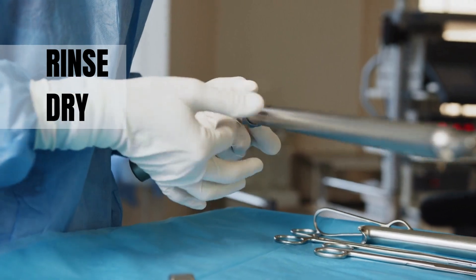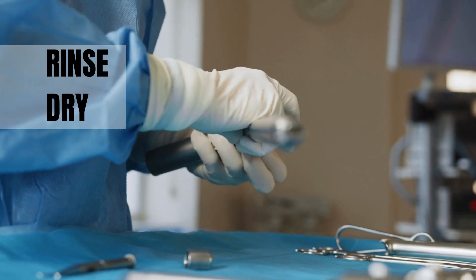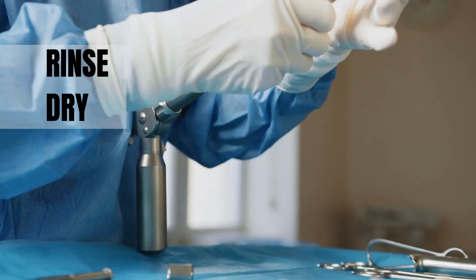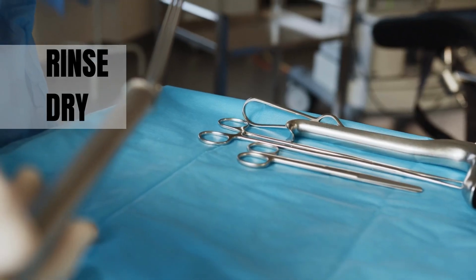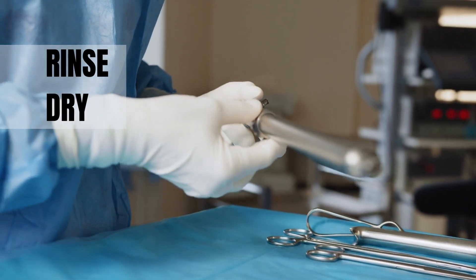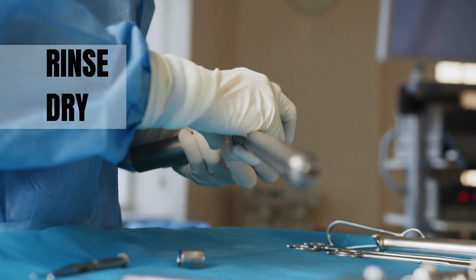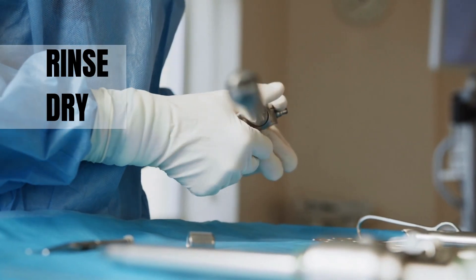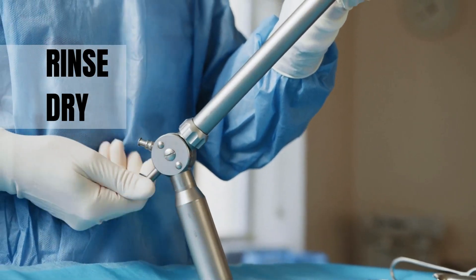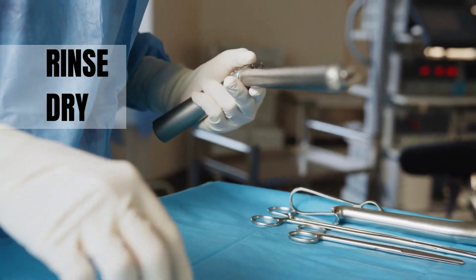Once complete rinsing is done, all instruments must be dried thoroughly. It is advisable to dry them with the help of an air dryer, but if that is not possible, you can wipe them dry with a cloth and place them in open air for some time for complete drying. Drying helps remove all water, other components, and multi-enzyme cleaner from the instrument, making the subsequent disinfection and sterilization process more effective.